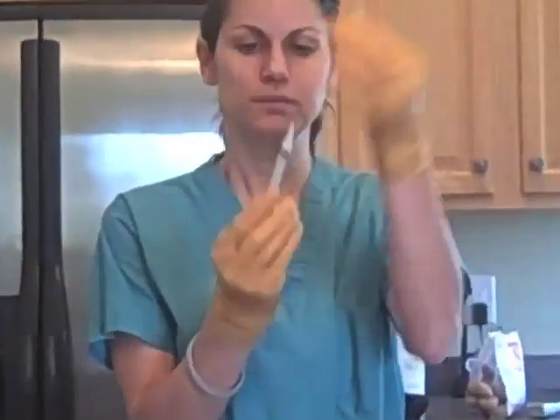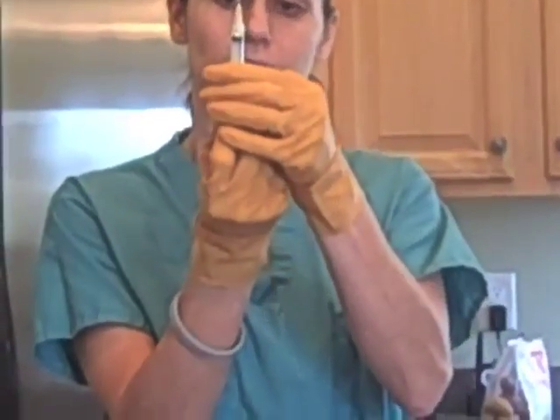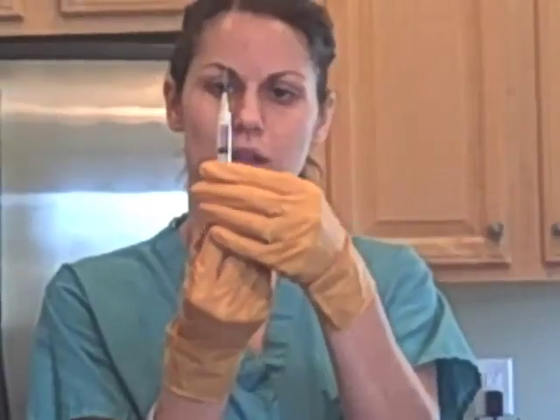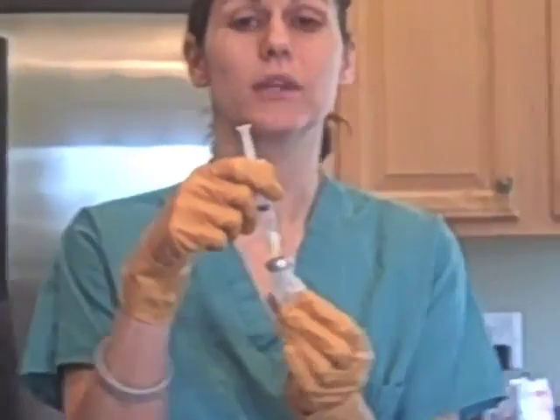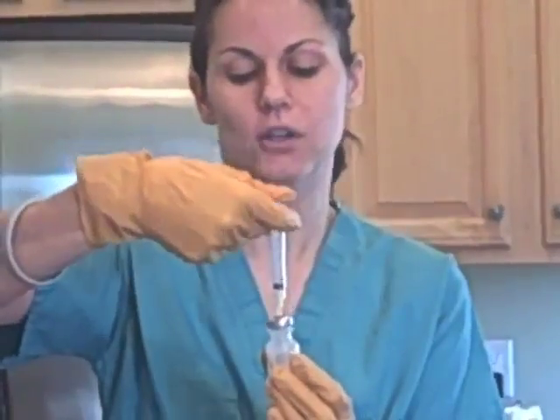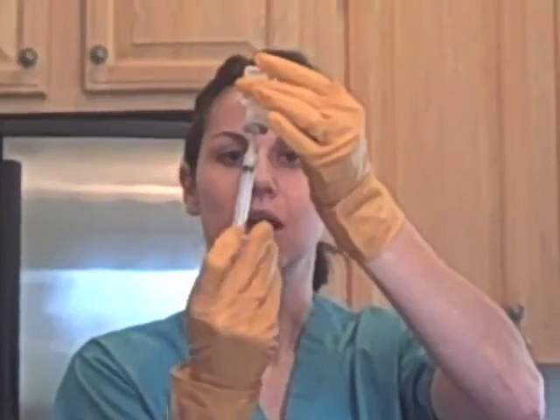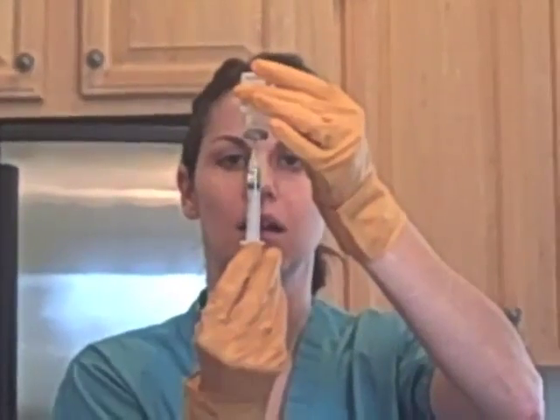We take the needle and we pull back to inject the proper amount of air into the multi-dose vial, which will equal the same amount we would like to administer. We turn the multi-dose vial upside down and we gently pull back on the plunger.